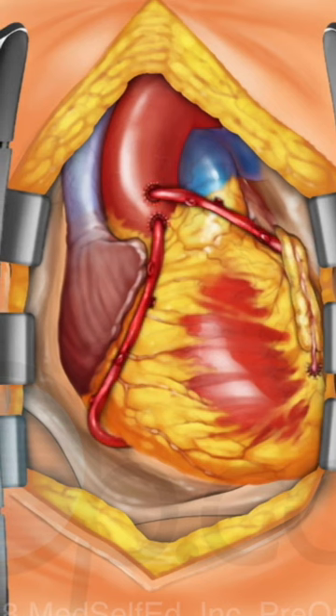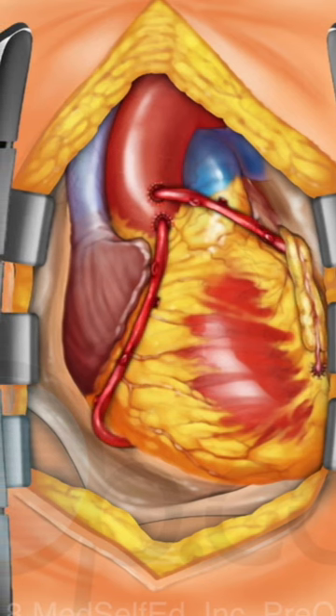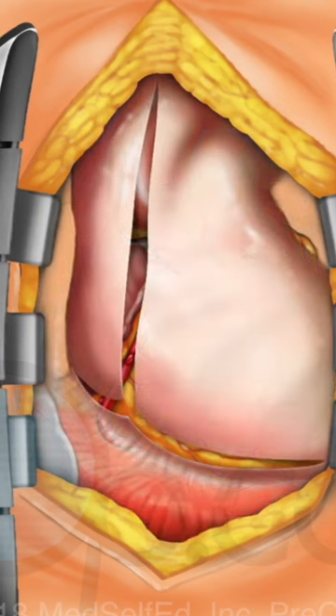Blood flow through the grafts is checked. The pericardium is positioned back over the heart.